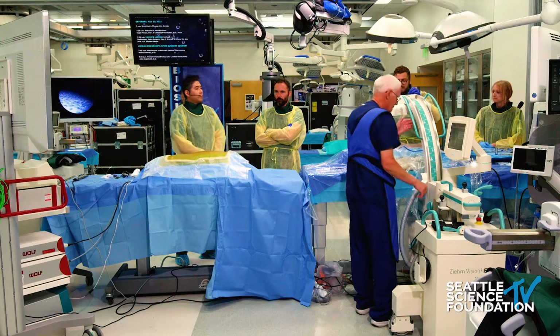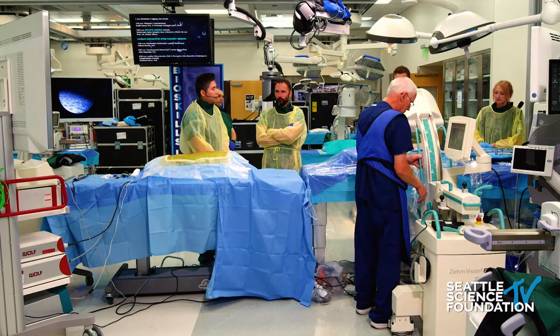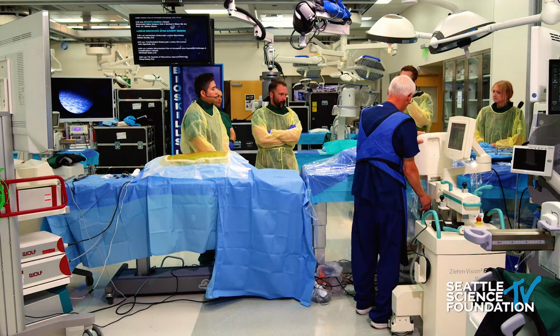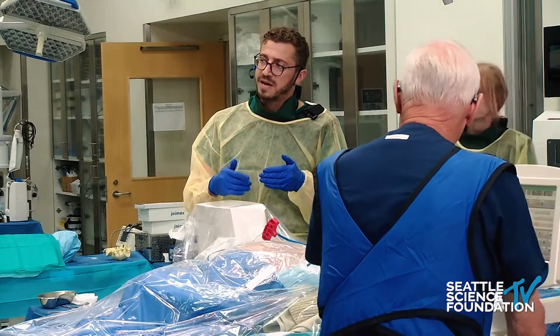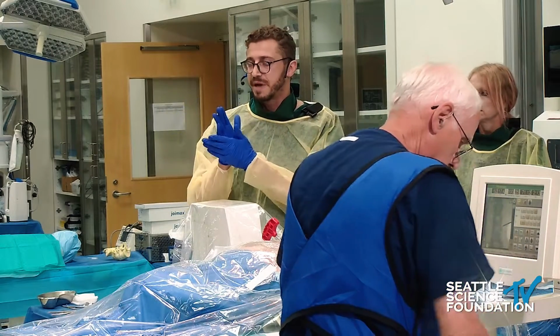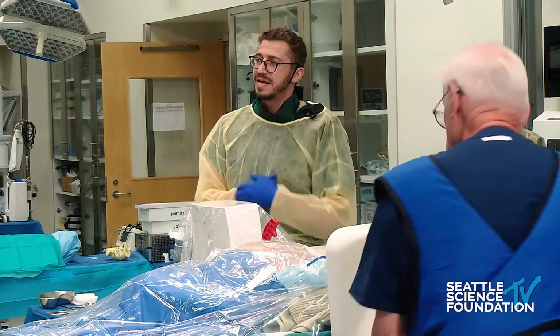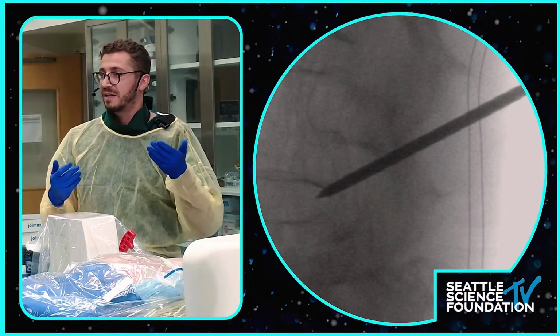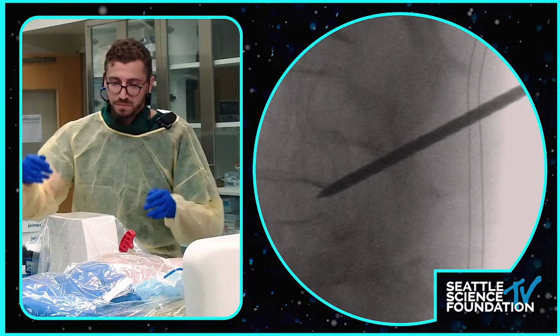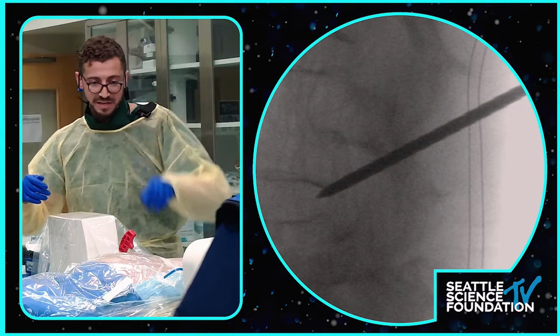So where you want to end up is the final shot before you put your endoscope in. You want to be on the AP on the medial pedicle line if you're in the lower lumbar spine. In the upper lumbar spine, you want to be at the mid pedicle line because the dura pooches out more. And on the lateral, you want to be on the posterior where the PLL is. So here, we're probably a little bit too ventral. So can you come back to an AP, please?